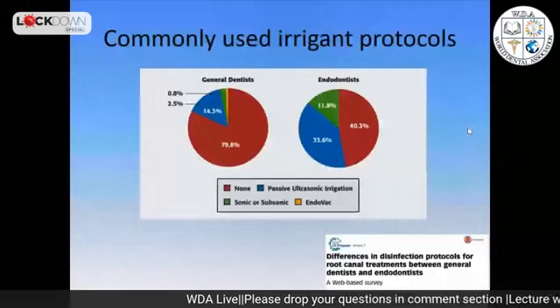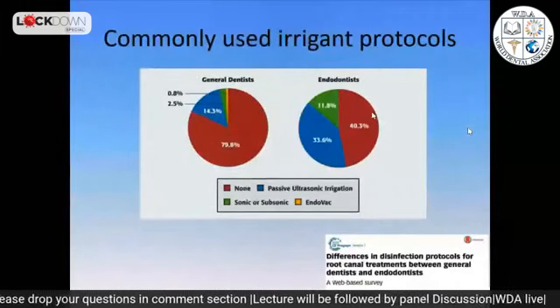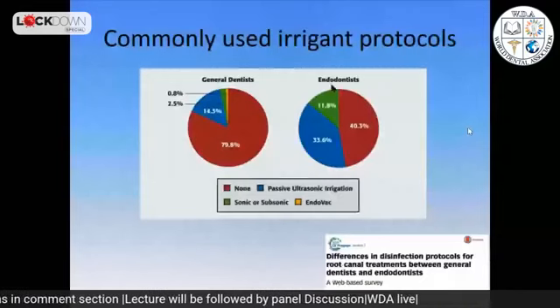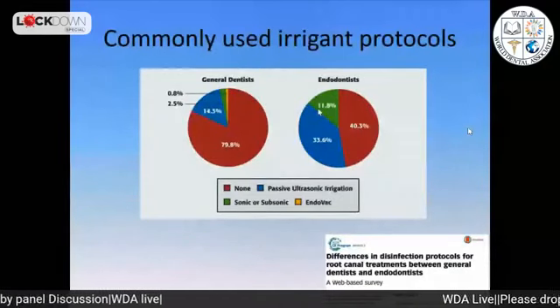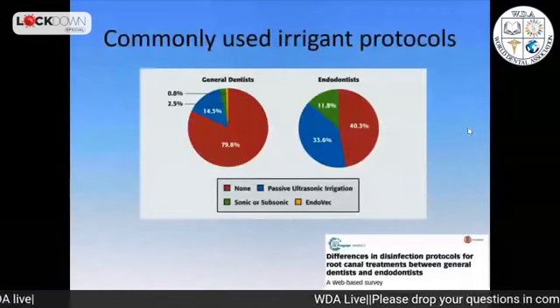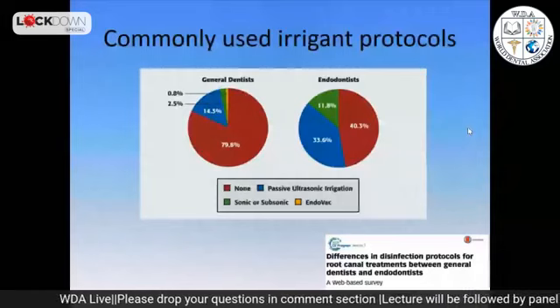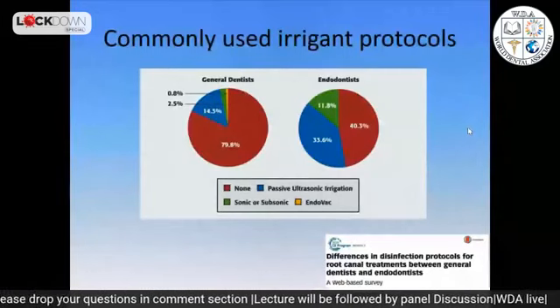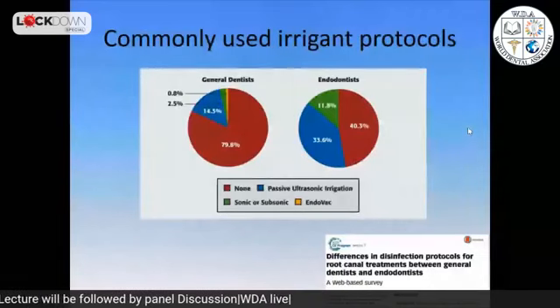Agitation. Well, when we go to the right pie chart, we see how common agitation is. Now, endodontists use quite a bit of agitation, while general dentists use less. So to some degree, endodontists consider that it's best practice to not only use some specific chemicals, but also to agitate them, to make them work.